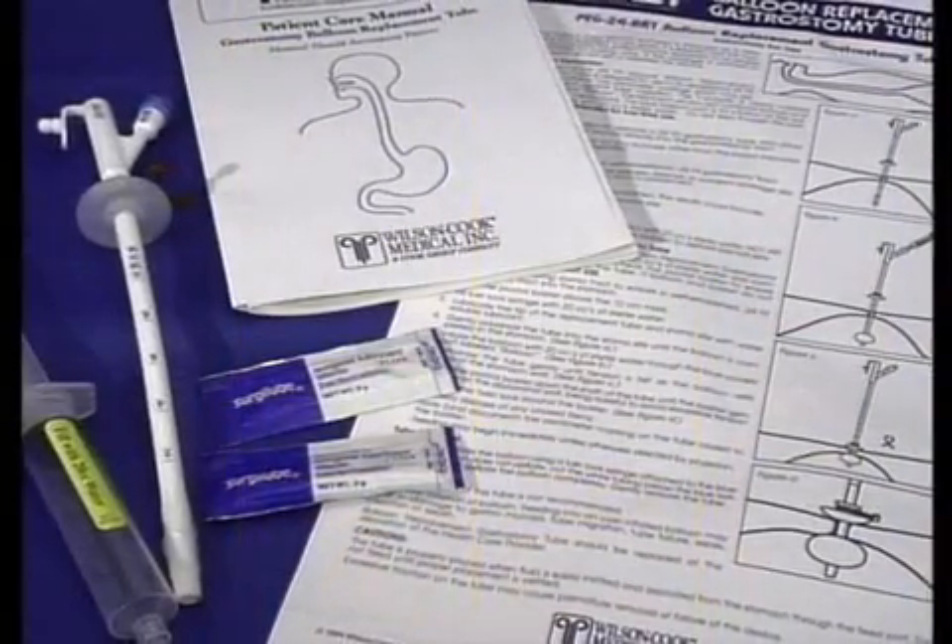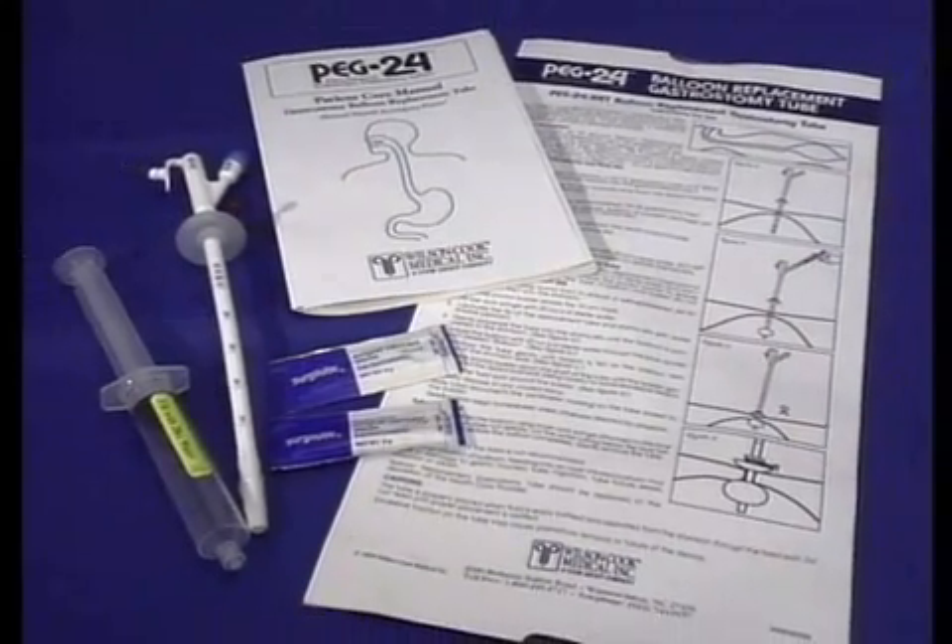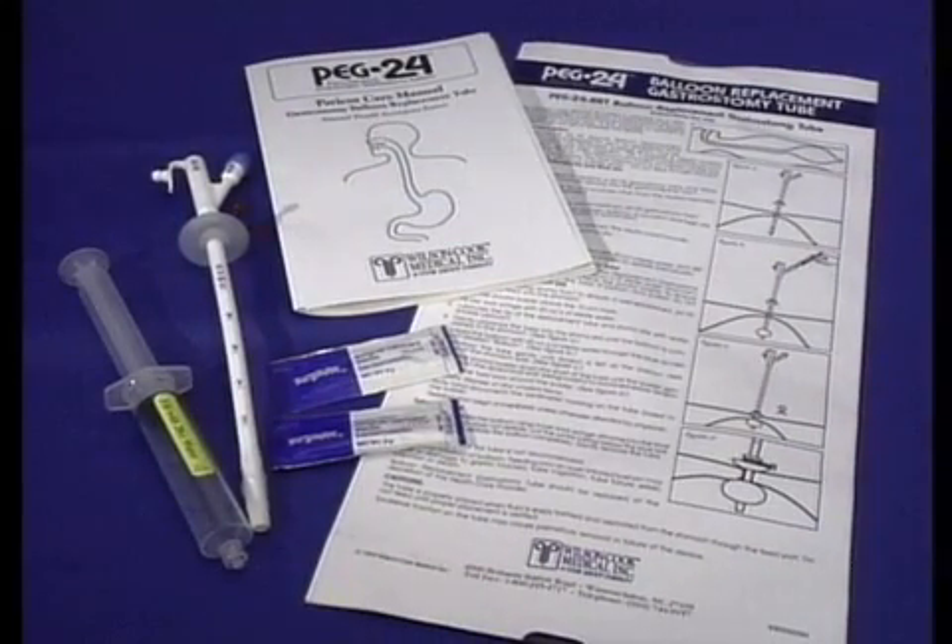Each PEG24-BRT includes one silicone balloon replacement tube, a pivotal bolster and twist lock, water-soluble lubricant, and a 20cc syringe. Instructions are conveniently printed on the outside of the pouch so sterility is not compromised.